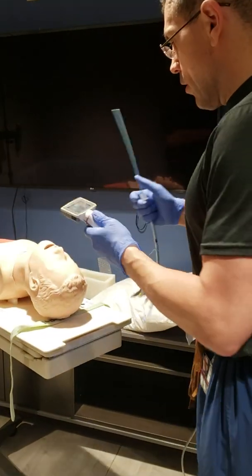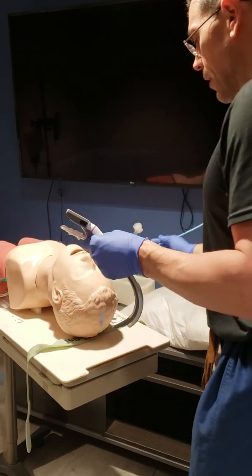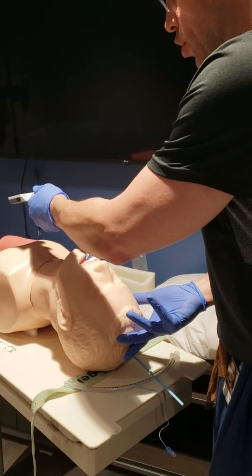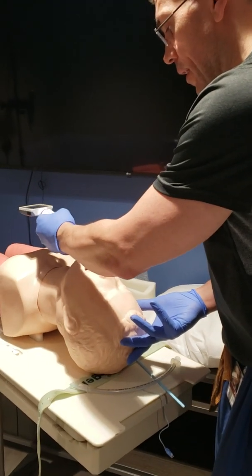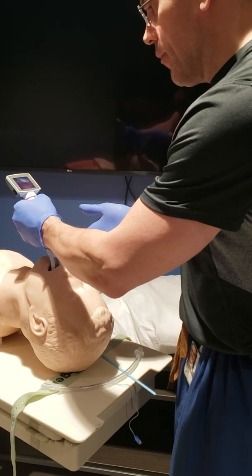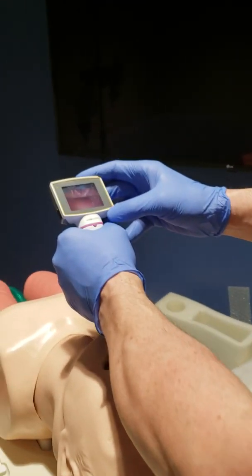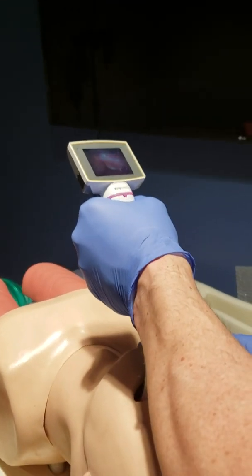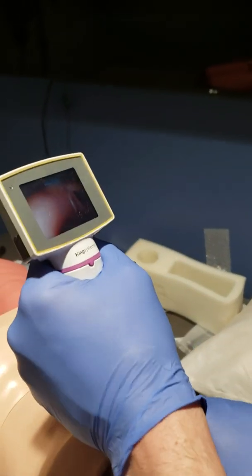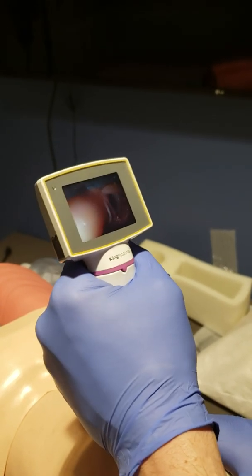So here, we're going to use this as a typical Glidescope. I'm going to go down with the technique of going straight back — follow the tongue down. So coming straight down, there's the base of the tongue. Coming in now to the vallecula, I pull up, and that's my opening.